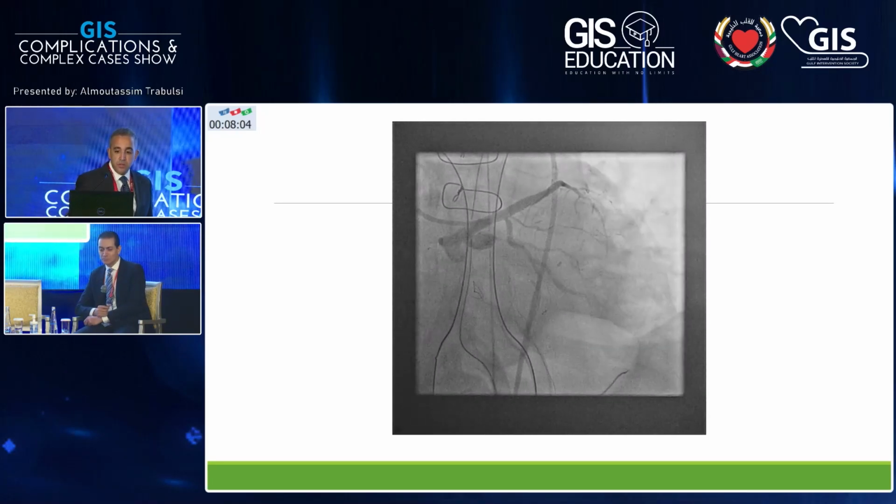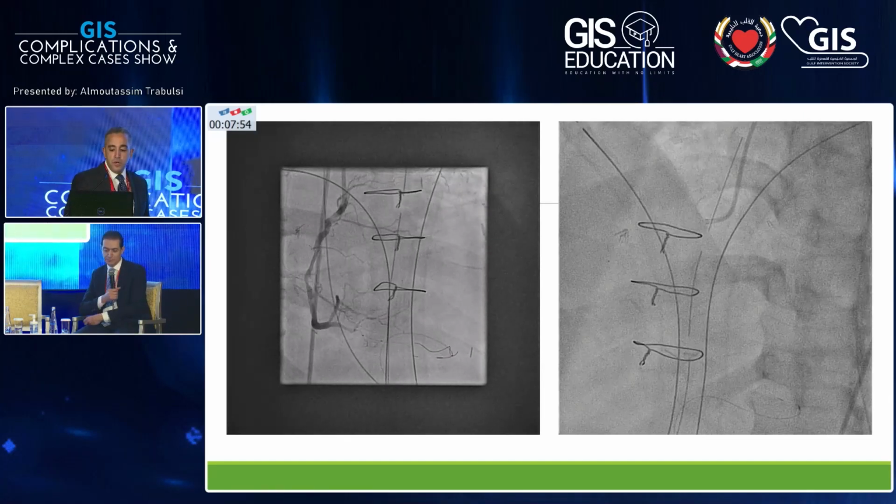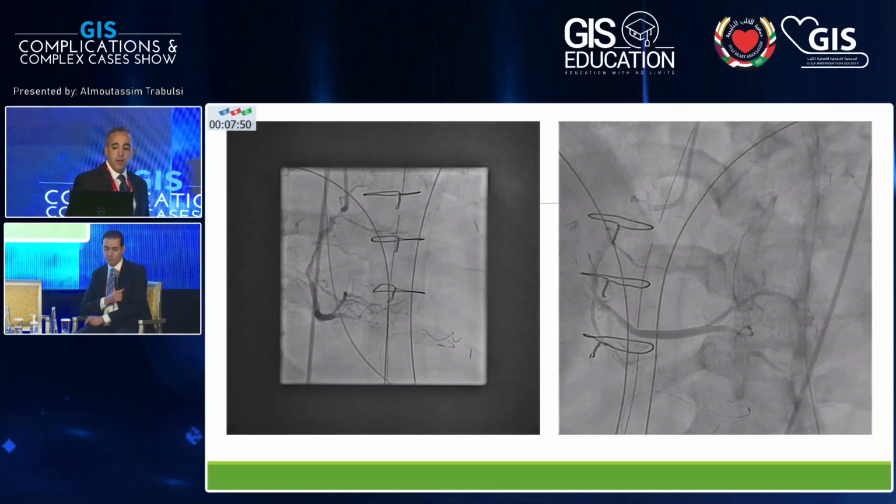Yes, and like the doctor said, there's a clip there, I think that was placed where the LIMA is, and I don't know, maybe that's the reason why the LIMA is occluded or not. And do you have the right coronary pictures as well? Yep. So immediately I moved to the RCA.